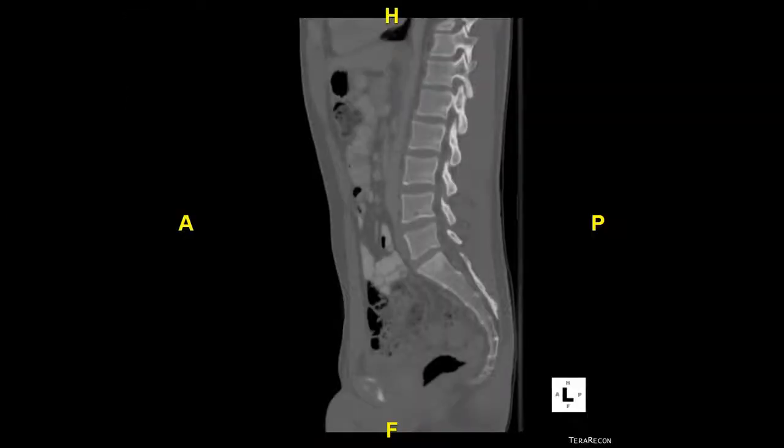Now we are entering the vertebral canal since we're starting to see some space next to the vertebral bodies. And I'll just very carefully outline that space in blue right here, just a little bit. Keep in mind that the vertebral canal will be a solid gray color on this picture since this is a bone window. We won't see structures like the conus medullaris or the cauda equina.